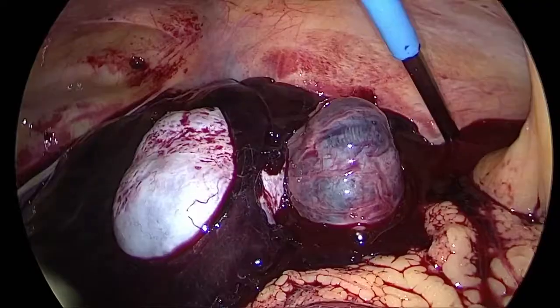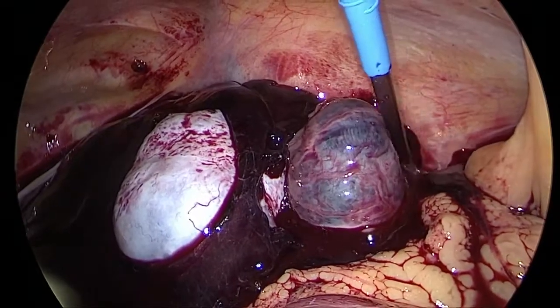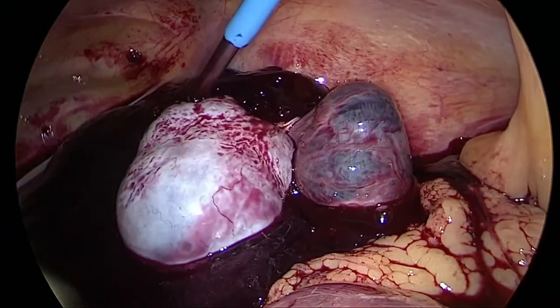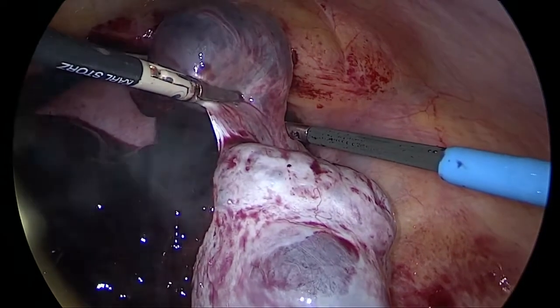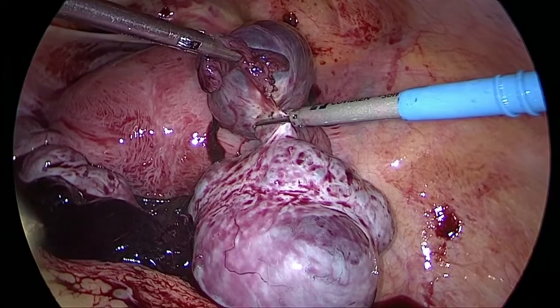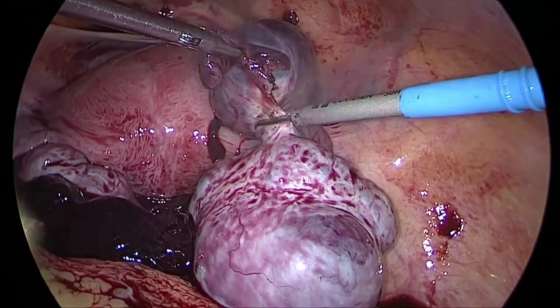Being a heterotopic gestation, we will not be able to use any kind of vaginal manipulation in this particular case. Using bipolar energy we desiccated the base of the ectopic mass, and using the harmonic ACE we dissected off the ectopic gestation.